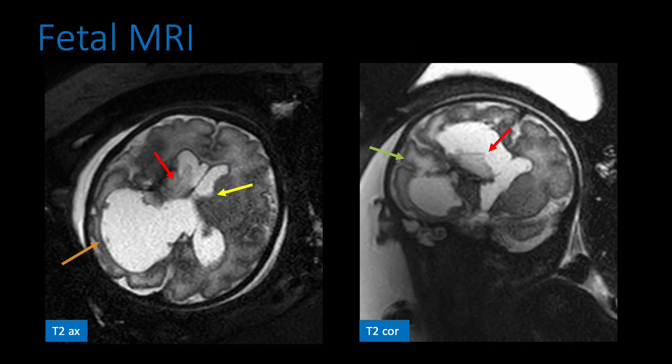Our patient presented for fetal MRI for further characterization of an abnormality noted on 20-week anatomic ultrasound examination. T2-weighted axial and coronal images demonstrate marked right ventriculomegaly with porencephalic changes along the posterior horn of the right lateral ventricle. There is grade 4 right and grade 1 left germinal matrix hemorrhage with right-sided cystic periventricular leukomalacia.